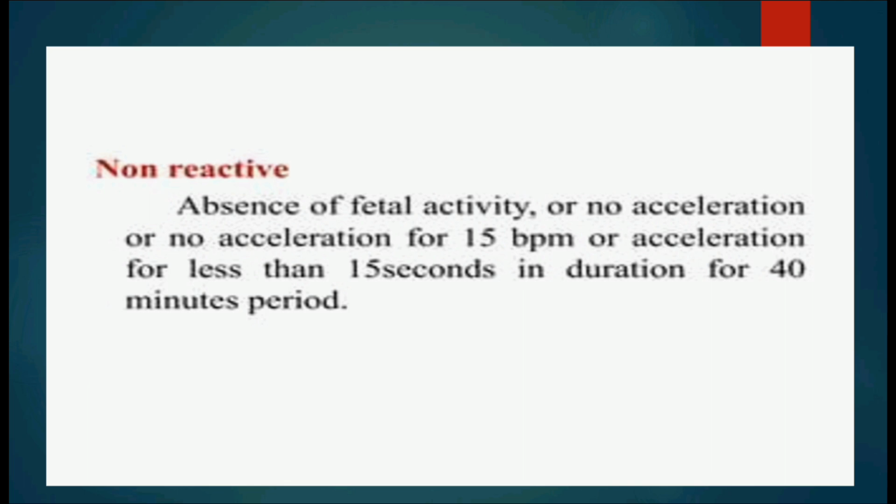And the next interpretation is non-reactive. It is the absence of fetal activity or no acceleration of 15 beats per minute, or acceleration for less than 15 seconds in duration, for 40 minutes, and is called non-reactive NST. There could be an acceleration but it does not last for 15 beats per minute or does not last for 15 seconds, so it should be a non-reactive NST.